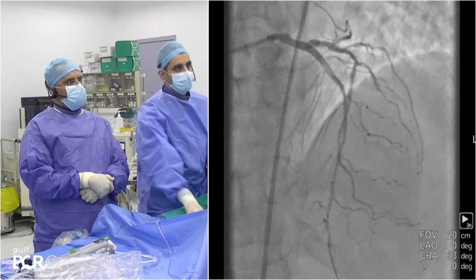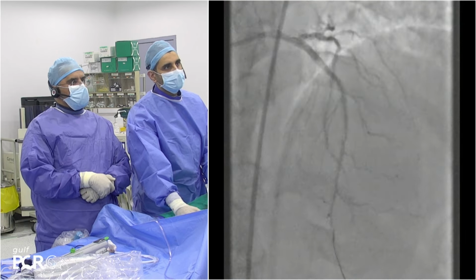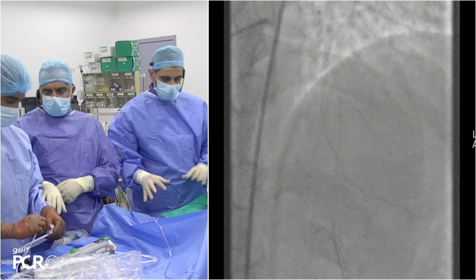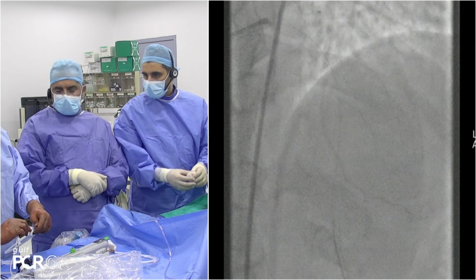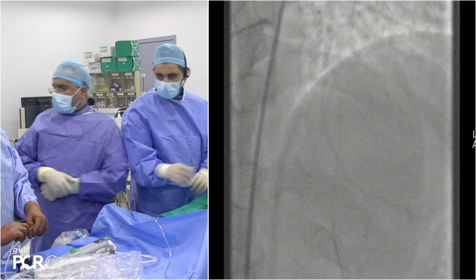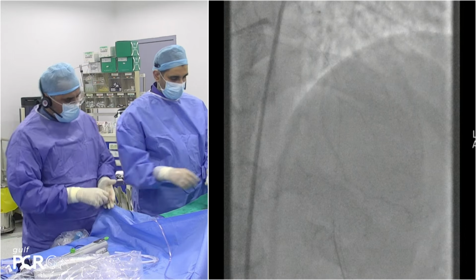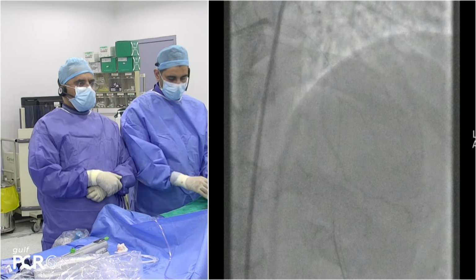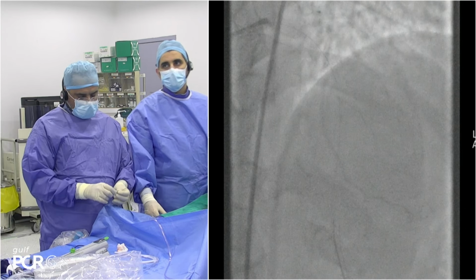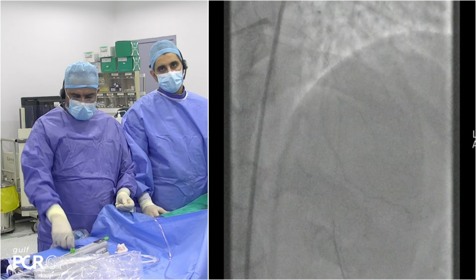So you have a huge experience of the evaluation by OCT of the different kinds of lesion, particularly here in the calcified lesion. When you look at this result, angiography and OCT result, what will you do in your cath lab now? Will you take a larger balloon, a different type of balloon? Okay, two things. The effect of this orbital atherectomy plus cutting plus non-compliant high pressure balloon was clearly suboptimal.